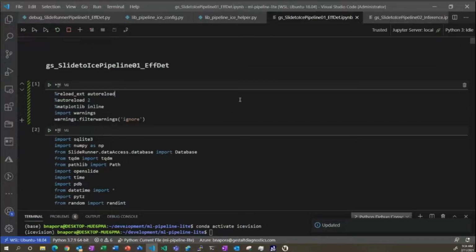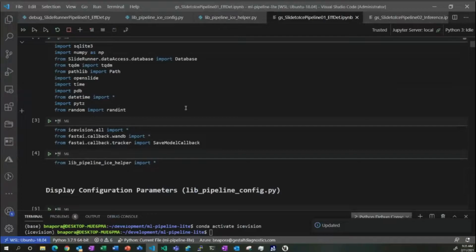All right. So I do most of my development in Jupyter and use VS Code to do any coding on the pipeline. This is running on my personal laptop. I use a couple GPUs for actual model building, but do most of my coding on my laptop.